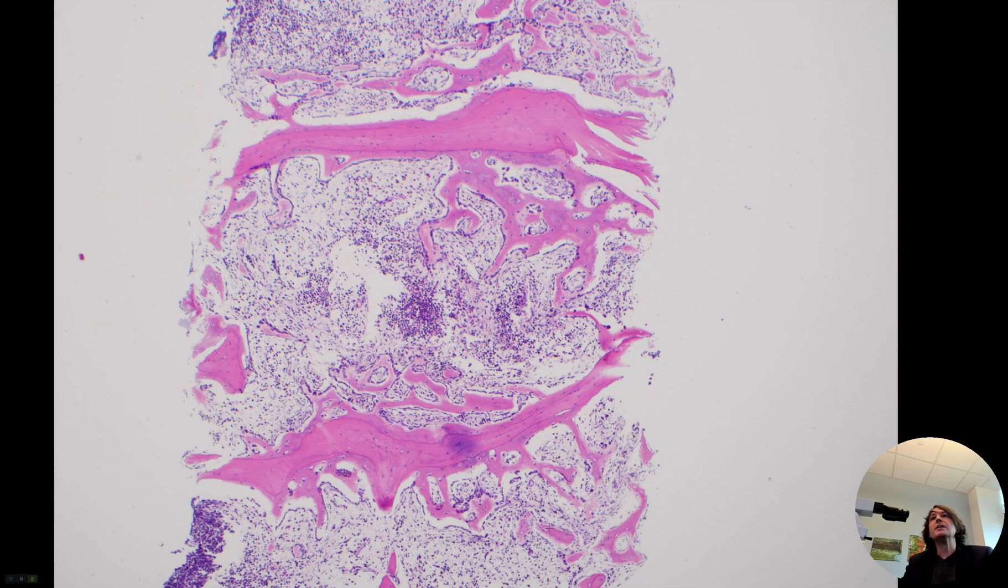Hi, I'm Dr. Jared Gardner, and today I'm going to show you what a fracture of bone looks like under the microscope when it's starting to repair.